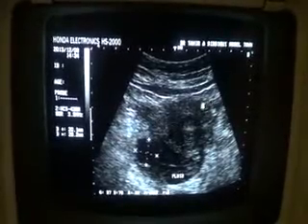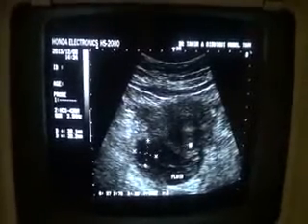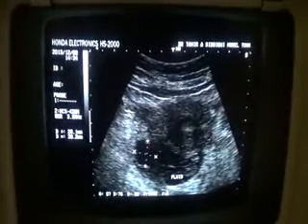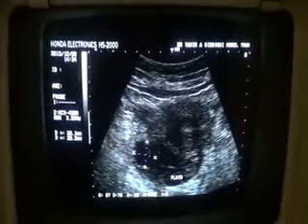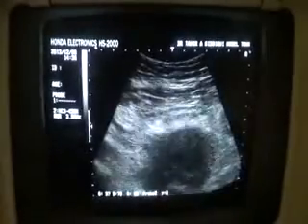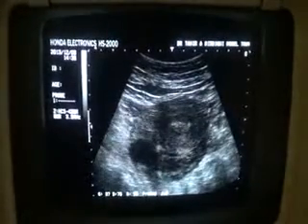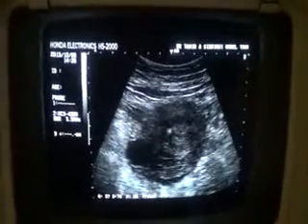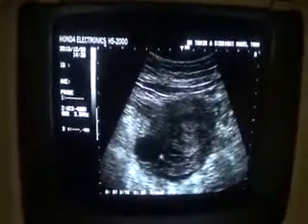The cystic structure measures 20 by 20 mm. This is the uterus in transverse section — the myometrium is normal and the endometrial canal is centrally clear. This is, in fact, a gestational sac, with the surrounding area showing bleed. This is all bleed.